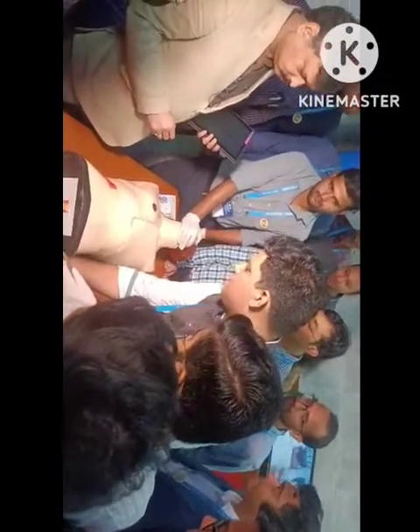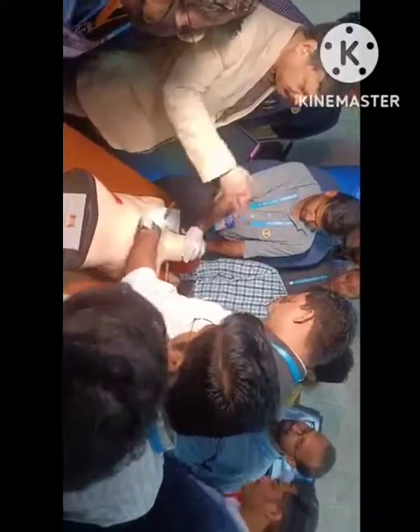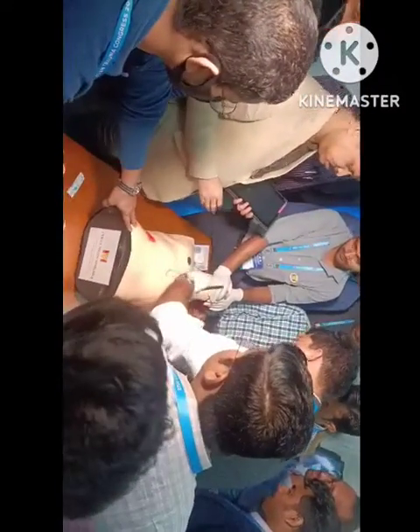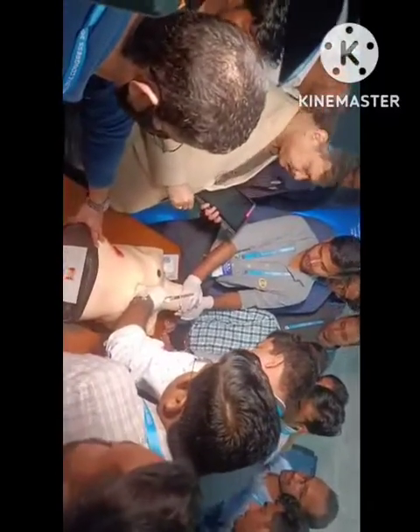And he will need only a nail thing scissor. As of now, we will not worry about anything. Go ahead. If we start worrying, then we will never be able to perform. In this procedure, we will never worry about even the phrenic nerve and this and that. Okay? We'll give the incision.